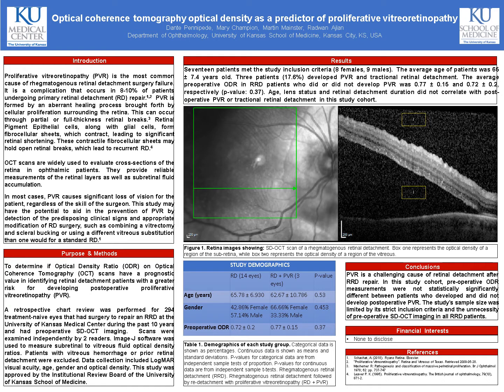The purpose of this study is to determine if ODR and OCT scans can have a prognostic value in identifying retinal detachment patients with a greater risk for developing postoperative PVR.